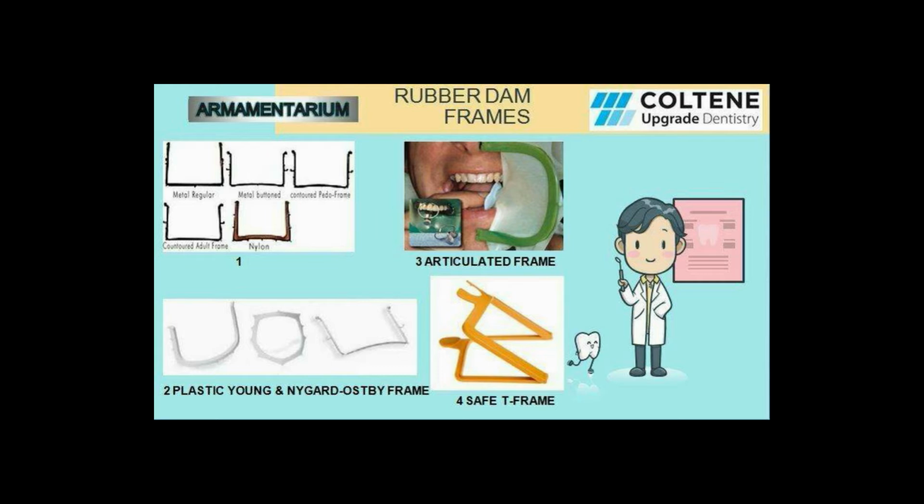The fourth picture shows the T frame or the safety frame. With this safety frame, the upper and lower borders get locked into each other so that the sheet gets locked into the complete frame, and there is no need to tuck the rubber dam sheet again and again into the corners of the rubber dam frame. So it doesn't come out of the frame easily, and it's quite easy to work with.